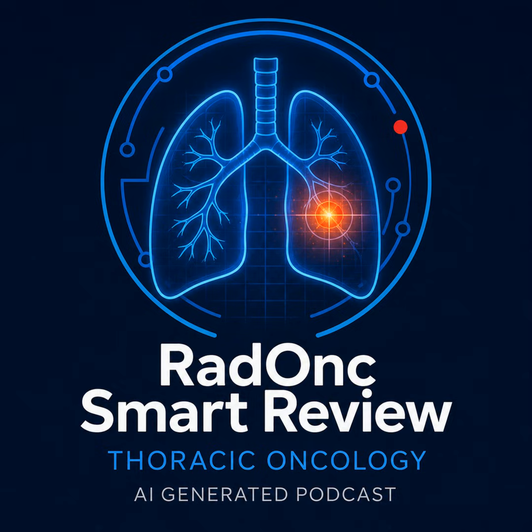We will. And for distant metastasis, I list any pleural abnormalities, contralateral lung nodules, and suspected extrathoracic organ systems. And the final critical step of that inventory is labeling every single finding you just listed with a degree of certainty. Like, is it confirmed, probable, indeterminate, or unlikely? Yes, exactly. And you must rigorously identify which of those findings actually have pathologic tissue confirmation.